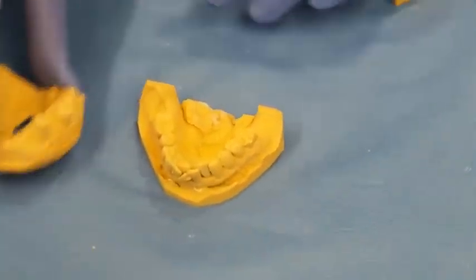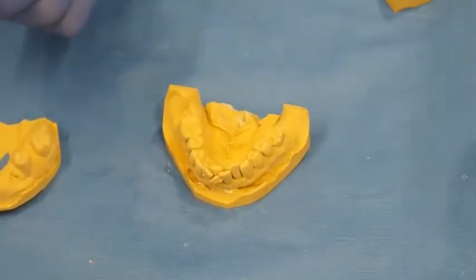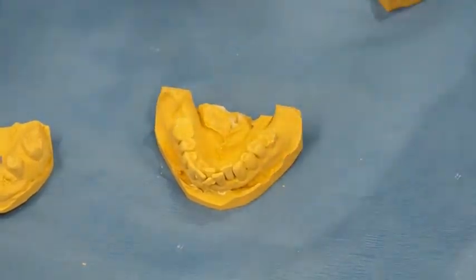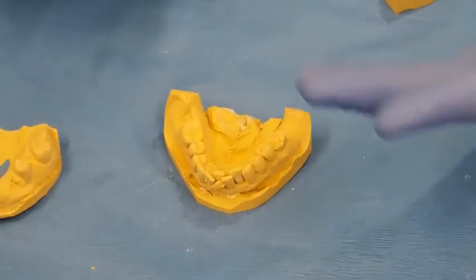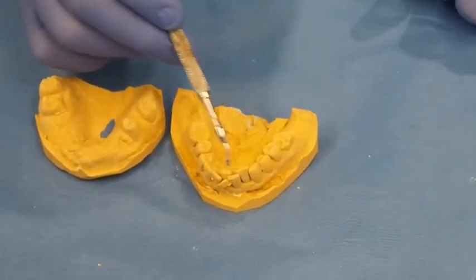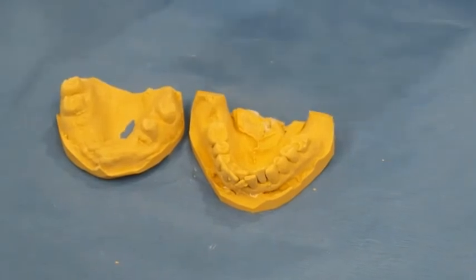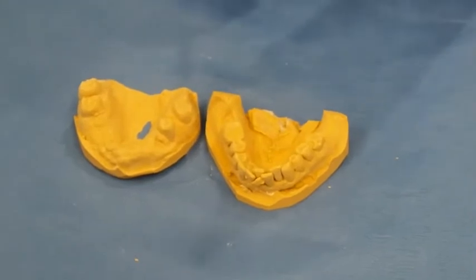Now, for the lower portion, this patient may be able to keep a few of the teeth, and we'll have to perform multiple extractions. For these multiple extractions, we can also do what's called an interim prosthesis. An interim prosthesis is kind of like an immediate prosthesis, where we do certain extractions in the mouth and then deliver an interim prosthesis with the extractions that we actually performed. We do have a code now for an immediate RPD, which includes the fact that you can make another RPD within a certain amount of time.